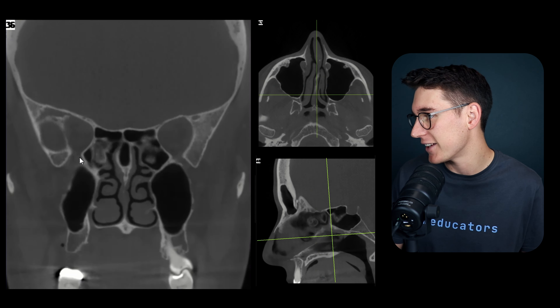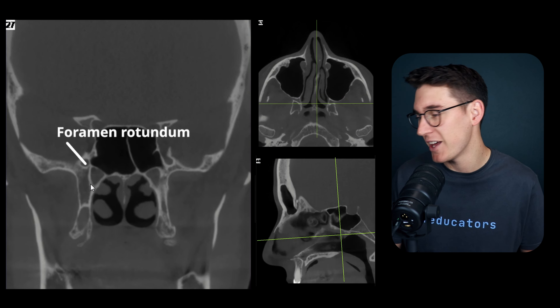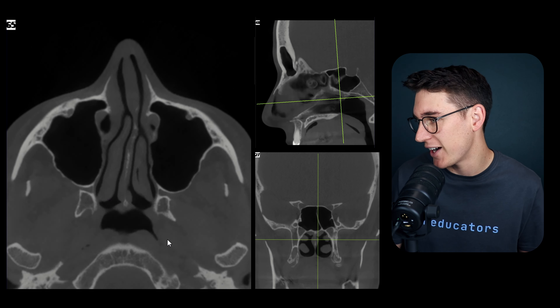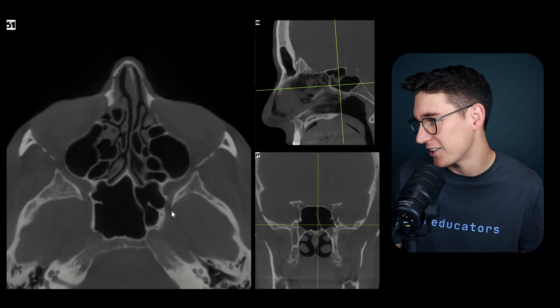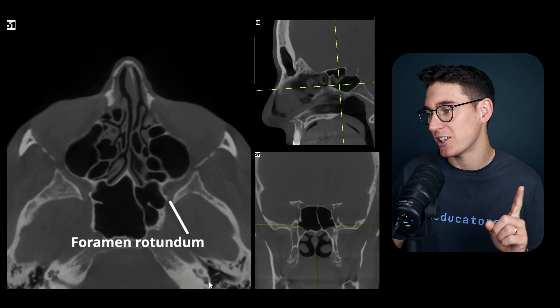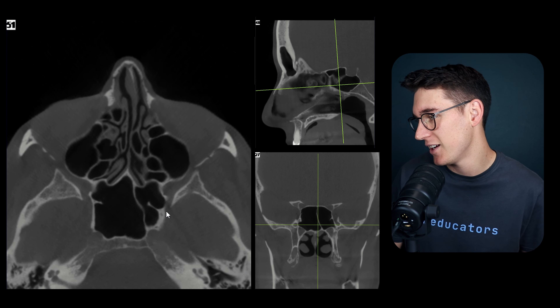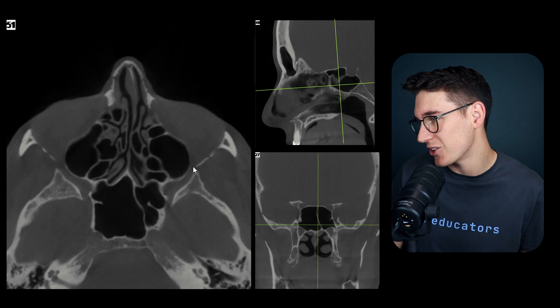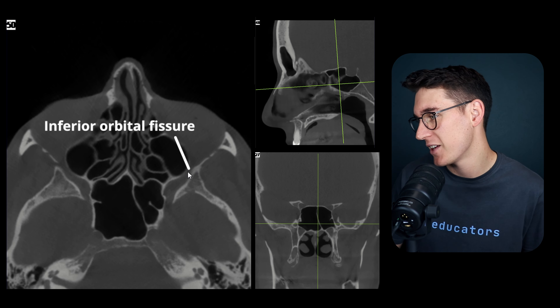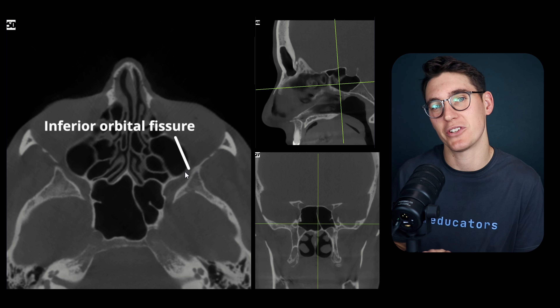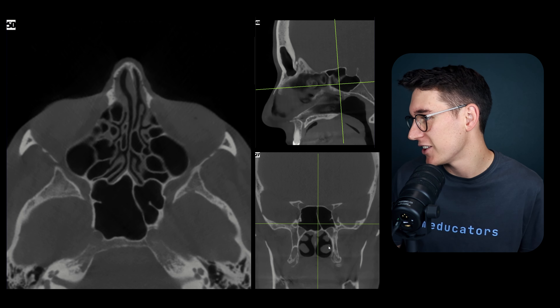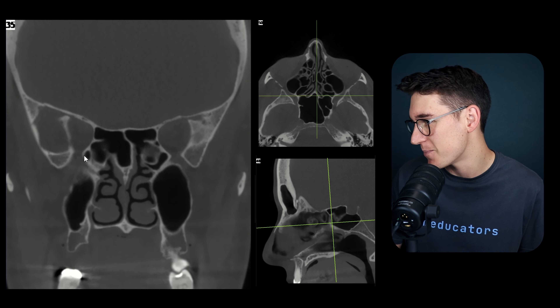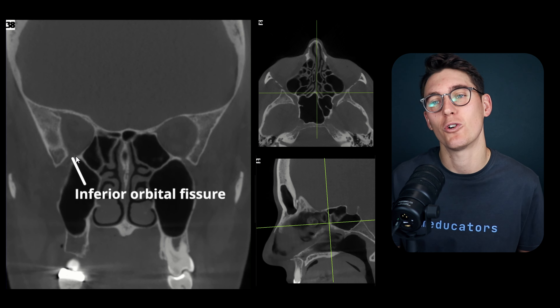Scrolling posteriorly we can find the foramen rotundum. The foramen rotundum runs anterior to posterior - like someone looking through binoculars - and we can see it on our axial slice here. The maxillary division of the trigeminal nerve passes through the foramen rotundum, and one of its branches heads into the inferior orbital fissure. When that branch passes through the inferior orbital fissure it becomes the infraorbital nerve.